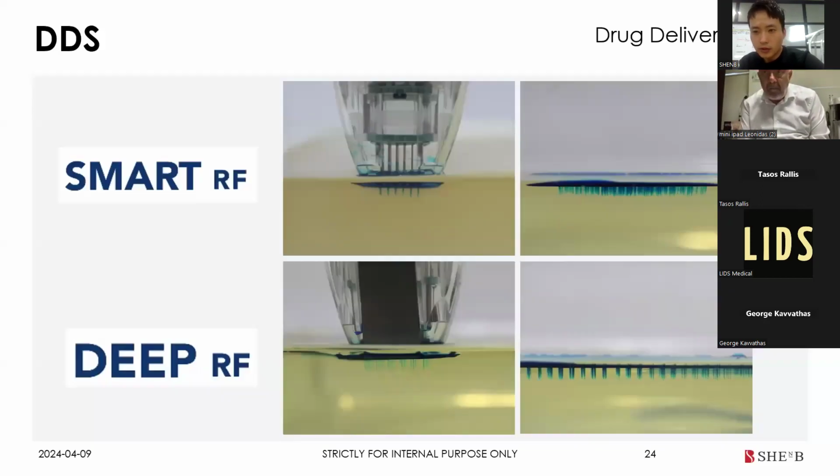We all know about this drug delivery system. Is exosome also popular in Greece these days? Yes, they are. Everywhere, I think. It's a global trend right now. And so far, a lot of doctors, not only microneedling RF doctors, but also exosome doctors and booster doctors, when I hear lectures in international congresses, they say that microneedling RF is the most efficient way to deliver the drugs into our skin dermis and generate the skin tissue reaction.